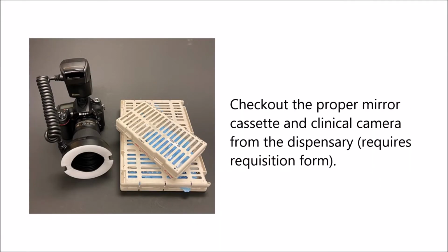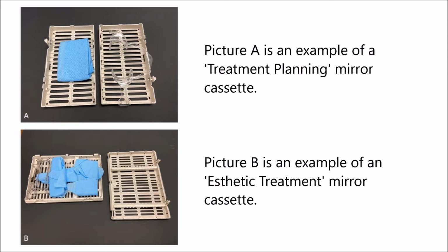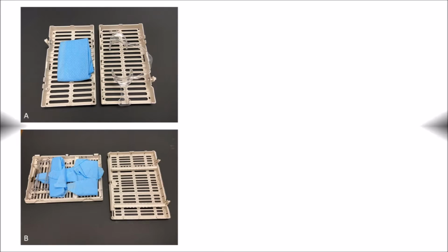Check out the proper mirror cassette and clinical camera from the dispensary. Requires requisition form. Picture A is an example of a treatment planning mirror cassette. Picture B is an example of an aesthetic treatment mirror cassette.